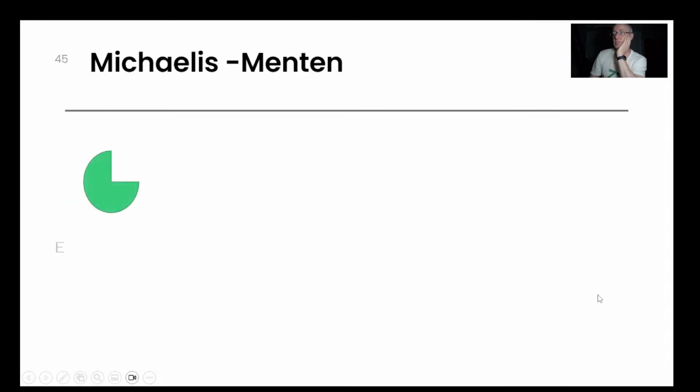I have been very interested in Michaelis Menten kinetics for a while. And so when somebody shows me data on a slide at a conference, even if you just show me the current, we can synthesize from that current what this sensor is actually doing. So this is a very simplistic Michaelis Menten treatment of a glucose sensor, because a glucose sensor actually has a third part in here, which is often its mediator, which is oxygen. But if I was just treating it as an enzyme with its substrate, then it's got kinetics.